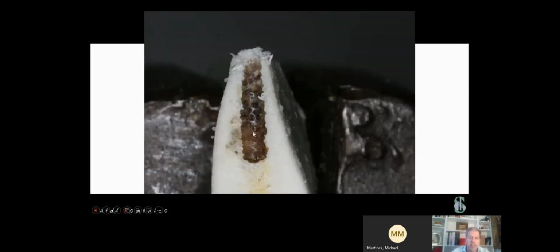Look, of course, here we have necrosis because we used the burr without water spray, and so we obtain overheating. But you can see in this position how traumatic it was for the bone.